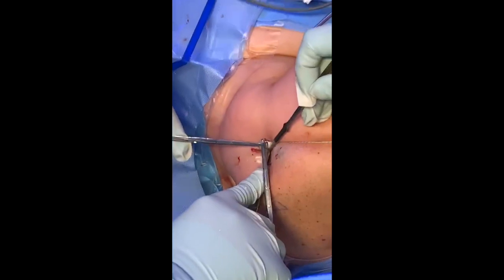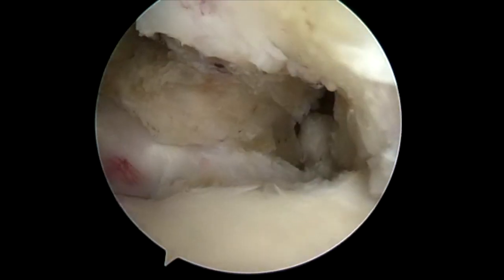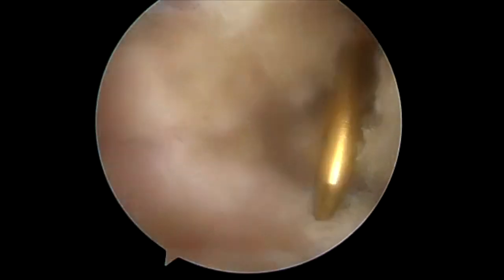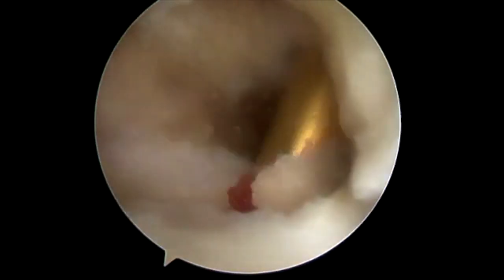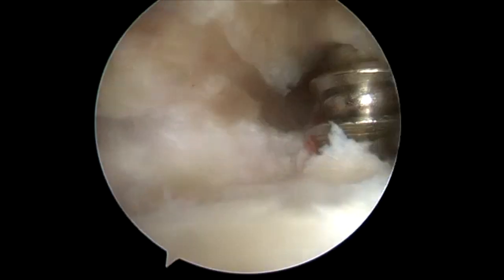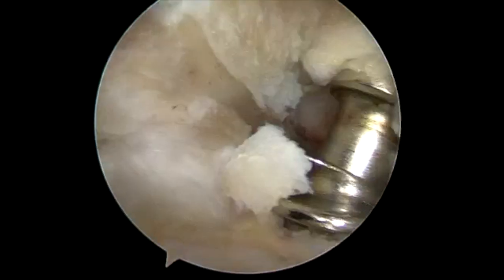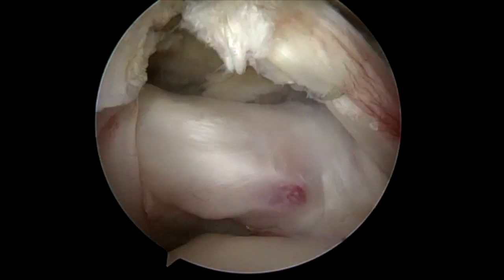I'm going to tension the sutures, trim the excess, and we're ready to go back in and finish the procedure. Back in the shoulder now, I'm coming in with a suture punch — this is for a Smith & Nephew 5-millimeter Healicoil knotless anchor, placed right at the anatomic tension point, right at the entrance of the bicipital groove. This is actually the hardest bone in the shoulder, and since this is a screw-in anchor, I'm going to tap it. Sometimes in softer bone you can get away without tapping, but I recommend it.